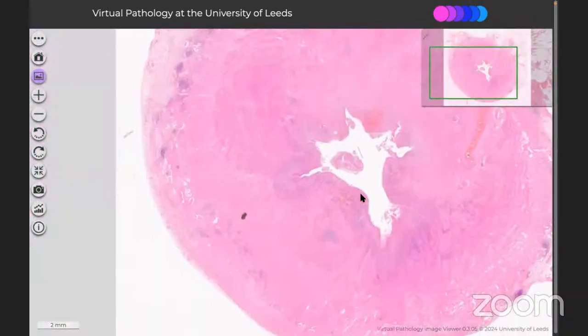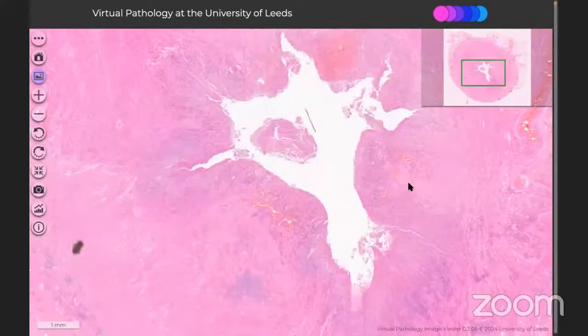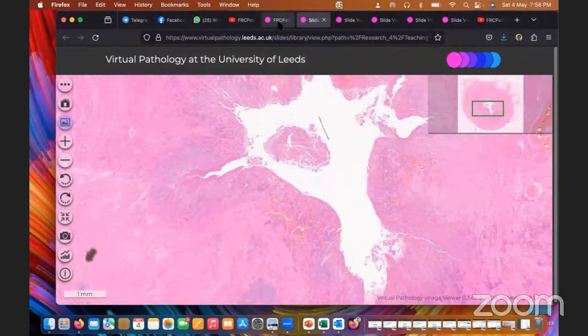Okay, and yes, you can suggest some other special stains like ZN stain and PAS. Actually, if you are not sure, just for completion's sake, it is not that you are considering an infective pathology per se based on these granulomas. You just want to exclude a superadded tubercular or some kind of fungal infection that can happen. You just need to be very sure that you are a safe pathologist. Okay, so staining can be done in these sections.